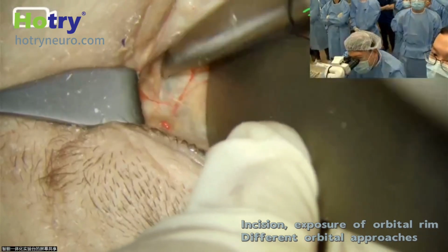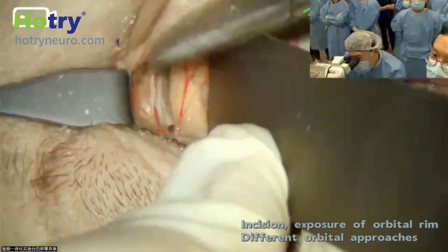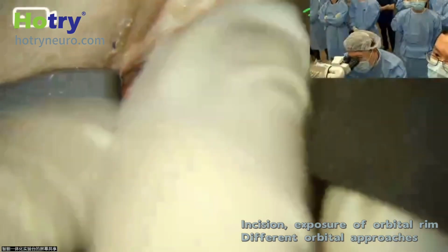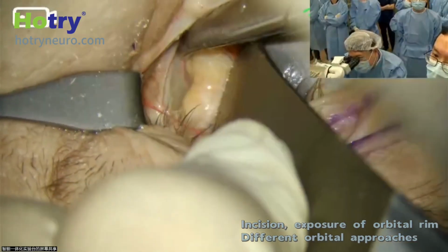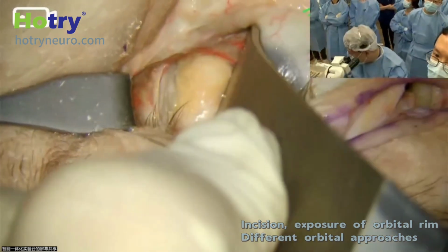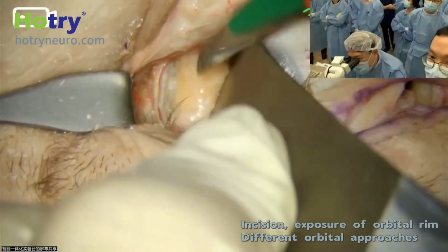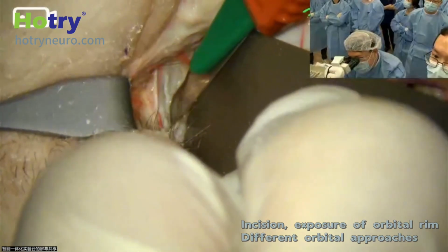Then we use a pair of blunt tip scissors to feel the posterior lacrimal crest. Once we feel the lacrimal crest, we spread the scissors. This is the medial orbital wall. Of course, we can incise the periosteum if we are doing the medial orbital decompression. This is the cutting of the periosteum.